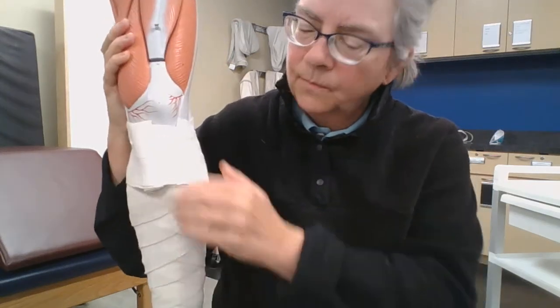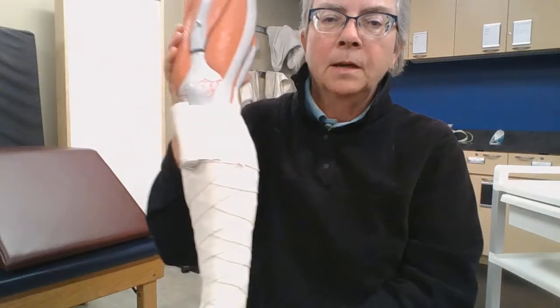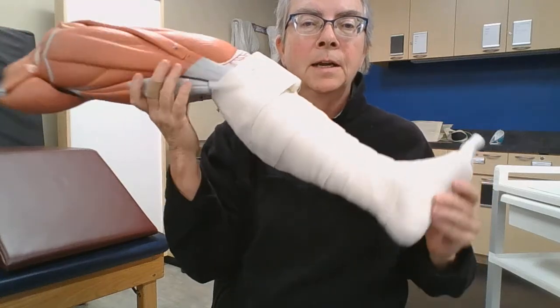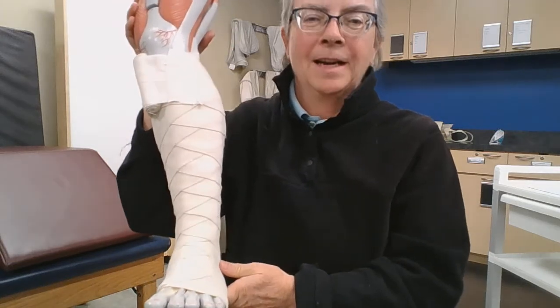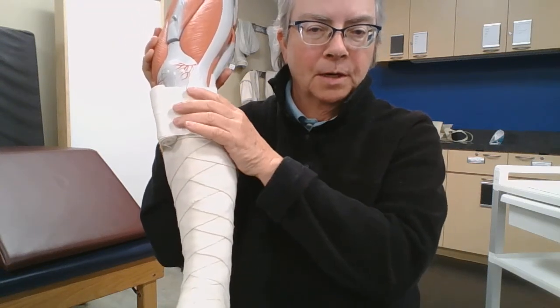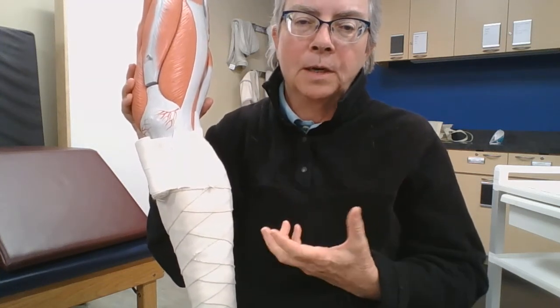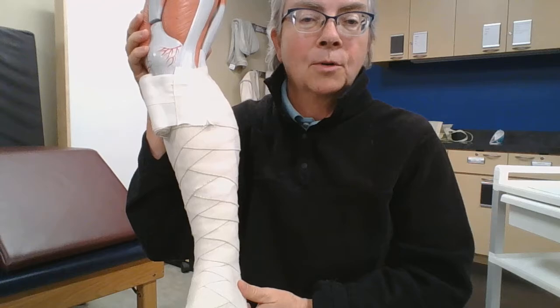So I've just taped it off here so that you would see that there might be extra fabric we would use. Okay, so that is reviewing that again. We don't go in the popliteal area, okay? We use a nice figure-8 pattern all the way up, which you will get very good at if you practice a lot. And we have more pressure distally with the wrap and less going up proximally, okay? So we can help that fluid go up towards the heart where we know it needs to be going, okay? And no wrinkles, no gaps.